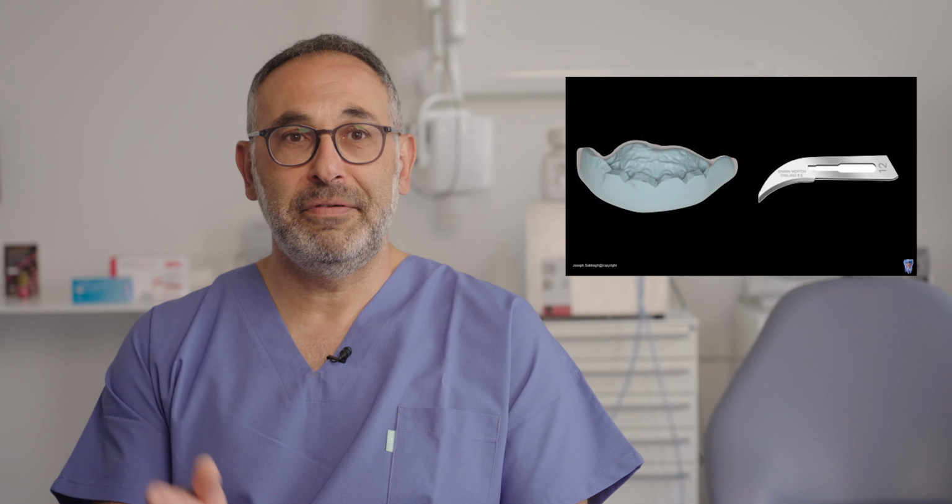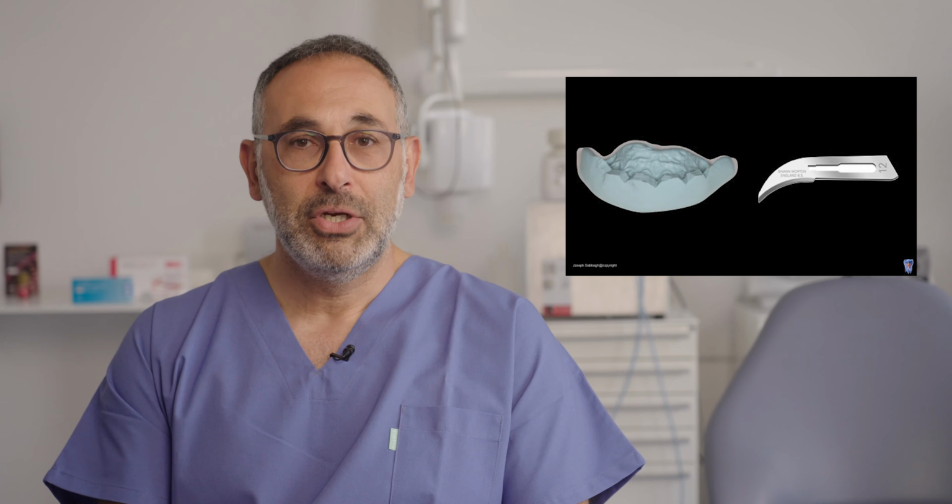One very important tip also: once the impression tray or the silicone is done, you can cut using a blade some V shapes following the gum shape in order to allow the excess material to flow out, so you can have less corrections and less finishing and polishing to do and have a better result for the mock-up.